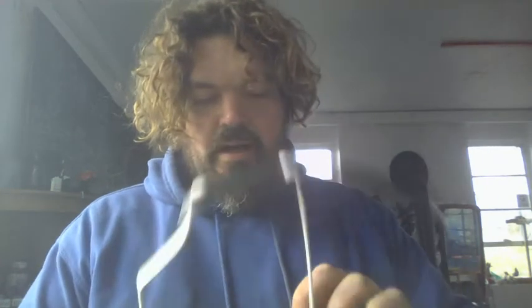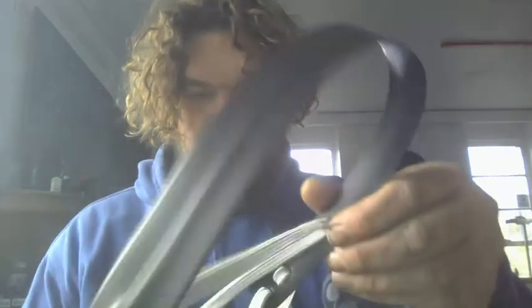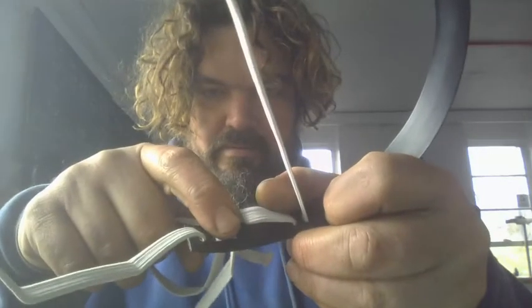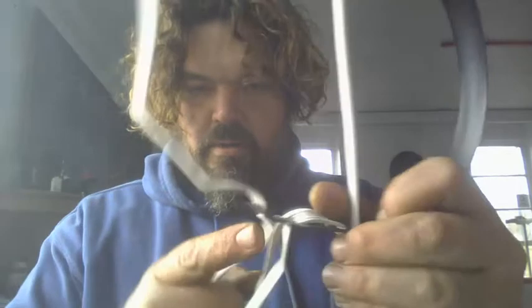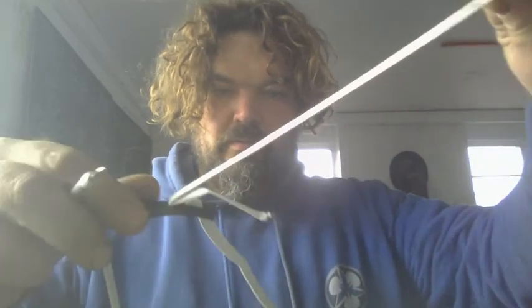So, I'm going here. I'm going on the inside again. I don't know if it's visible. And I'm going to come in here. And then I'm going to come out, of course, here. Because I can't go here. So, there is a bit of crafty work. You see, it should align with the inner one.